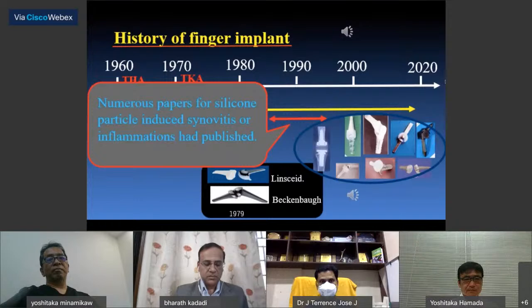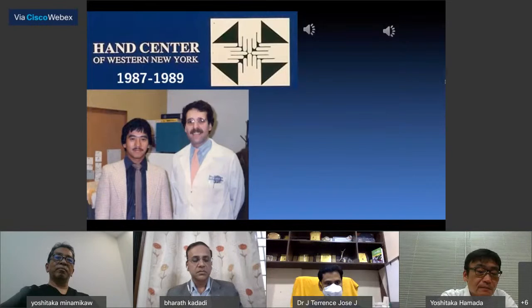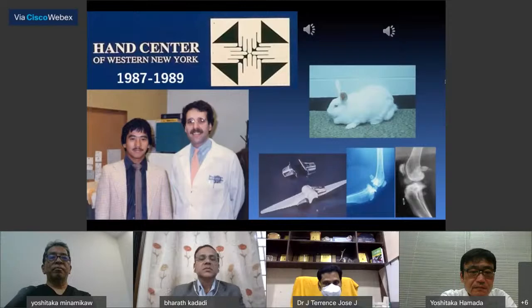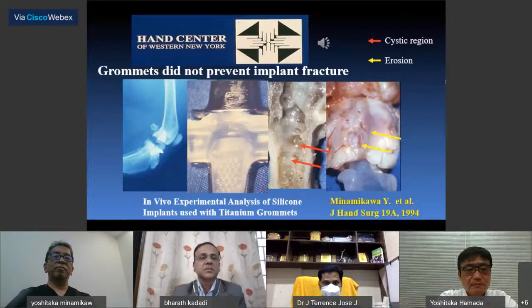When the entire world was skeptical of silicone, I started my research with Dr. Palmer in the US. The project was to put silicone implants into rabbit knees. Half grommets did not prevent implant rupture. Specimens after 12 months showed cystic lesions in the canal and erosion in the femoral condyle.